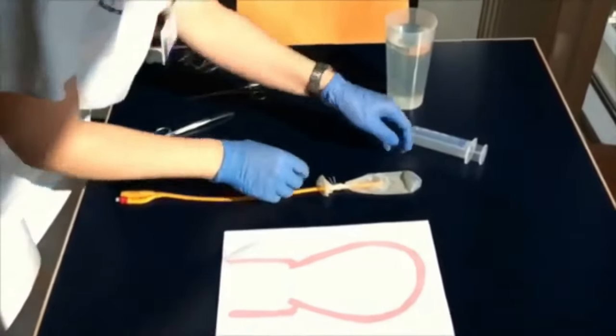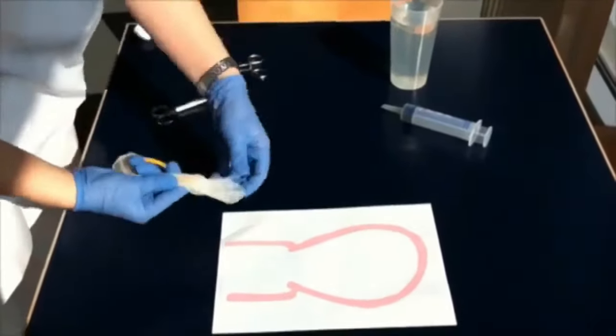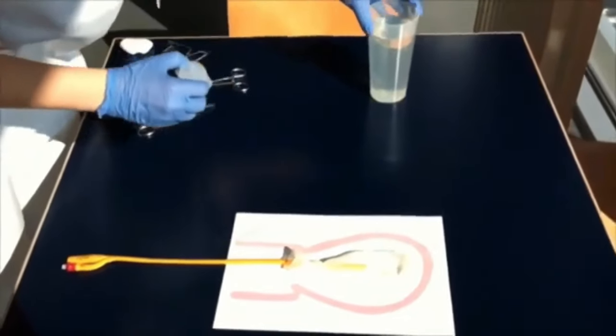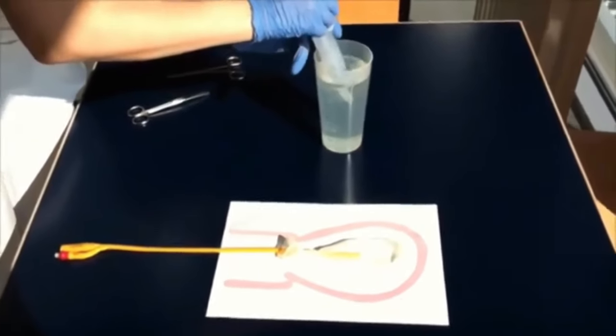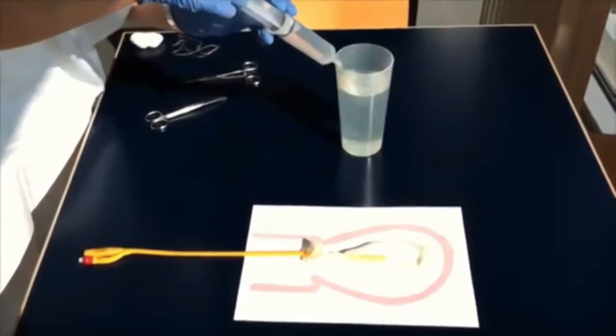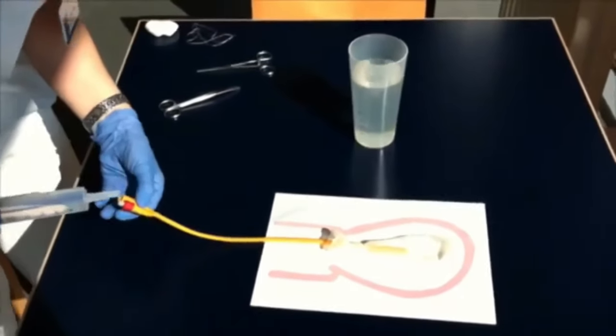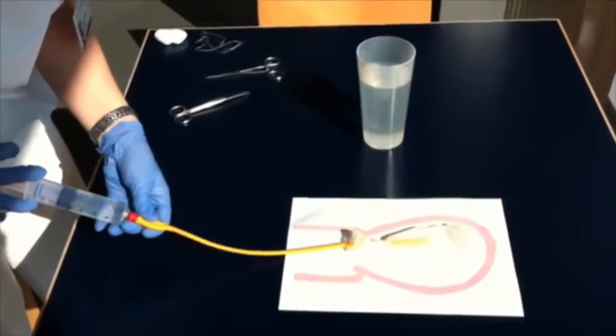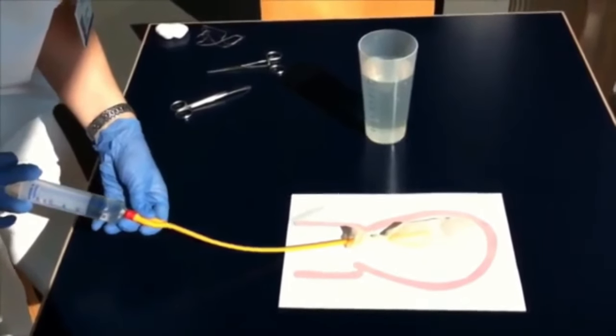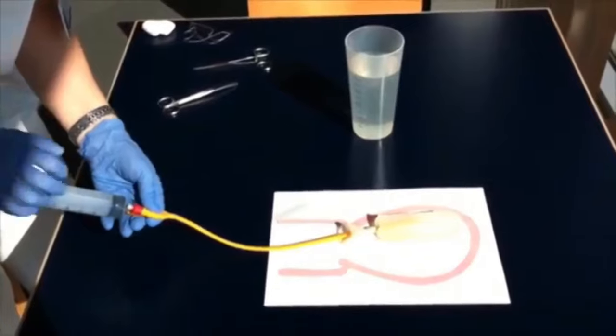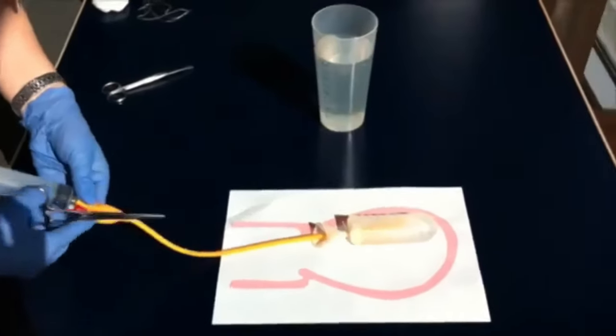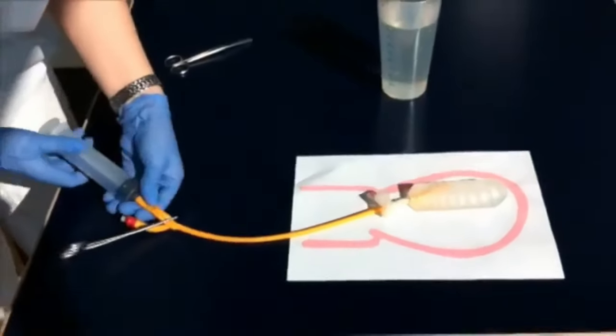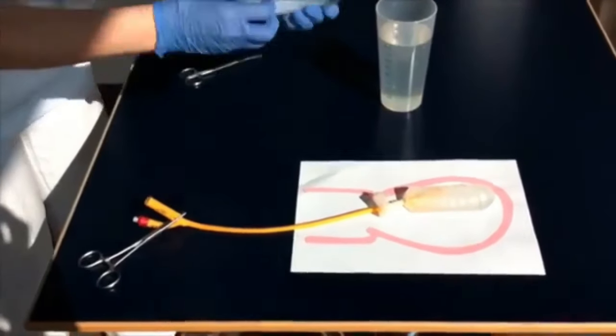Now he has inserted the balloon tamponade into the uterus, which is very easily seen by all of you. Now he will pick up the Foley's catheter, and from the end where we inflate the balloon, he is going to push 50 ml of ringer lactate. Just to keep the inflated fluid inside the uterus from coming out, he has clamped the other part of the Foley's catheter so that the ringer lactate does not flow out.